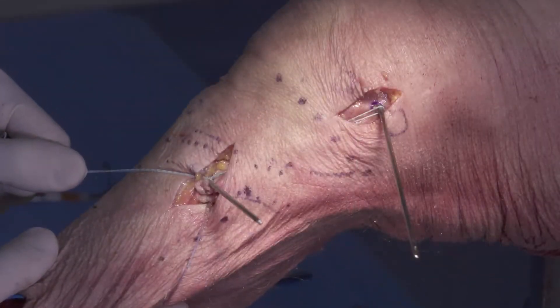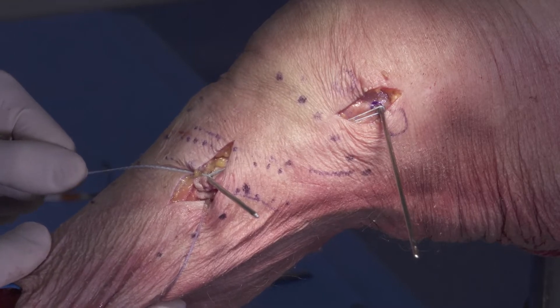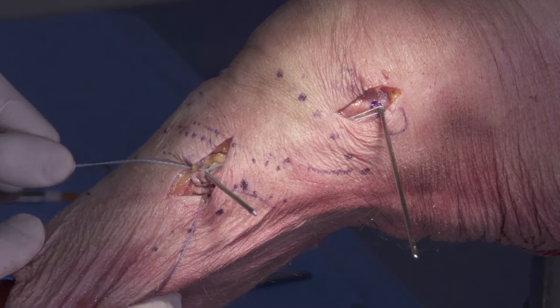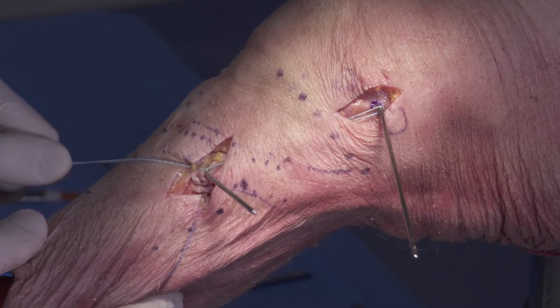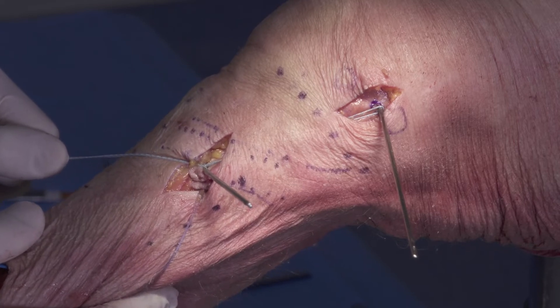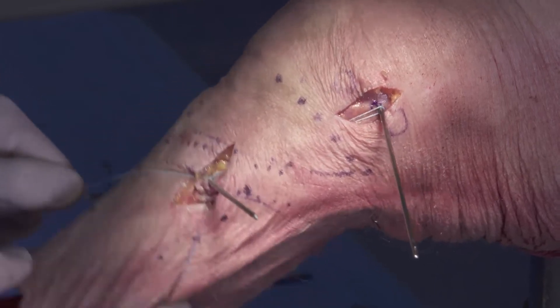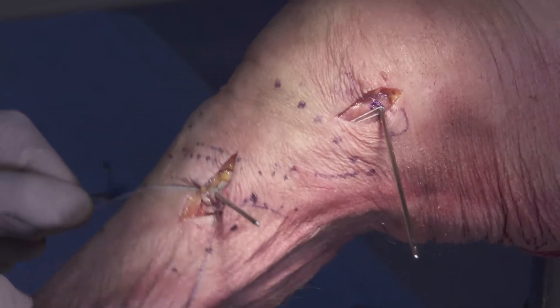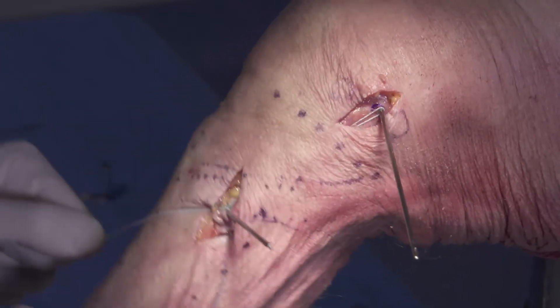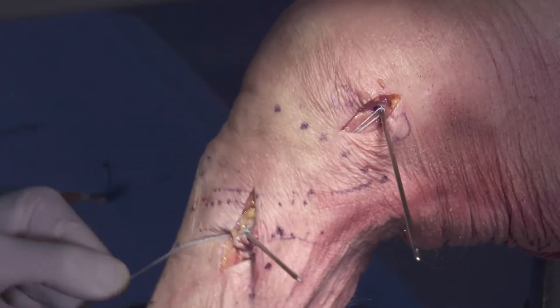At this point, I just like to check that I have the appropriate anatomic position of my pins. We want our MCL graft to be isometric. I've taken a number two suture, looped it around my femoral pin, brought it under the skin down to my insertion site, and looped it around its pin as well. I'm going to range the knee to make sure that my suture is isometric through a range of motion. We can accept up to about a millimeter of anisometry, but preferably we want a full isometric graft, and these pin sites are going to work good.